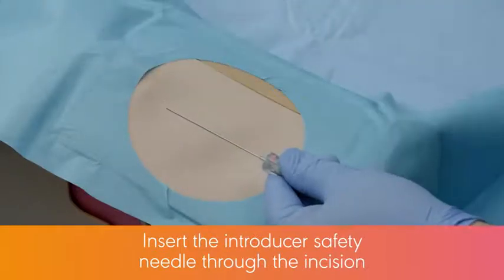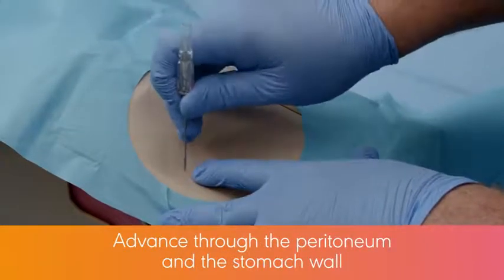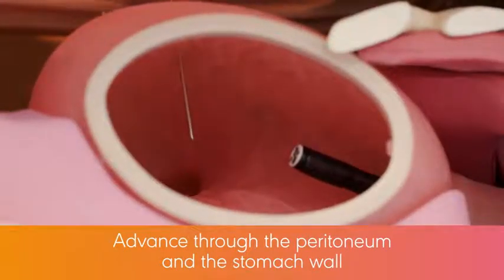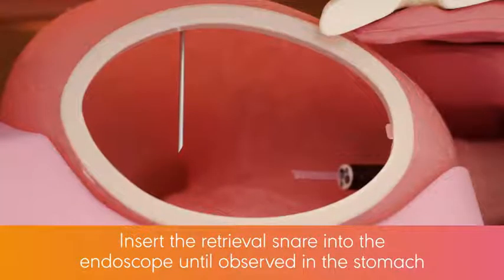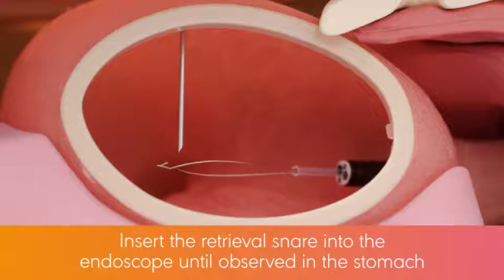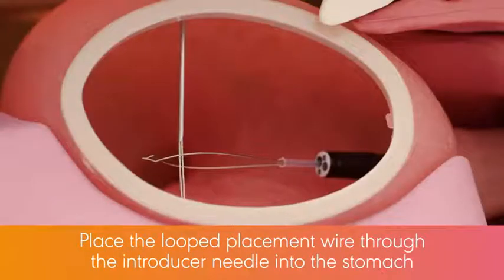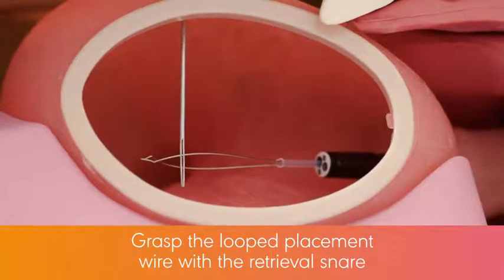Insert the introducer safety needle system through the incision, advancing through the peritoneum and the stomach wall. When the introducer safety needle is observed in the stomach, insert the retrieval snare into the endoscope and push it through until observed in the stomach. Place the looped placement wire through the introducer needle into the stomach and grasp the looped placement wire with the retrieval snare.